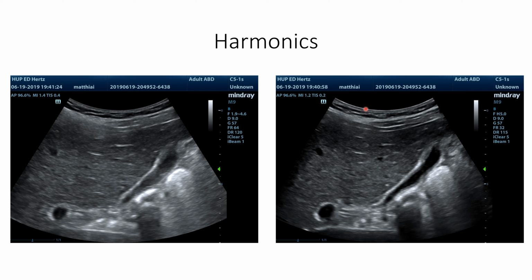So really, when you only listen for that harmonic, in effect the sound that comes back is a lot more of a skinnier type of beam, a lot more laser-like. And without getting into the details, this artifact junk in the no-harmonics gallbladder is not strong enough to make a harmonic. So all of that junky artifact filling up our gallbladder gets taken away when we're only listening for the harmonic coming back. That is a bit of an oversimplification, but it's already getting boring and we've got to move on.